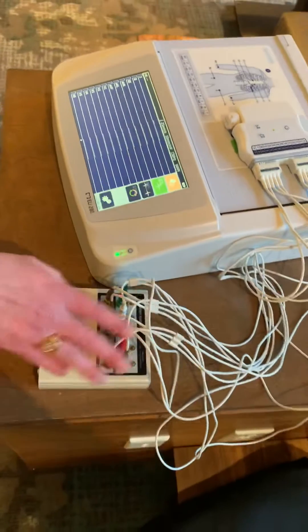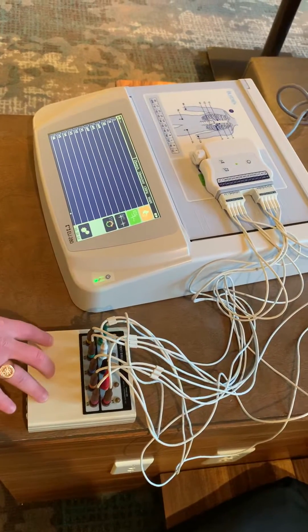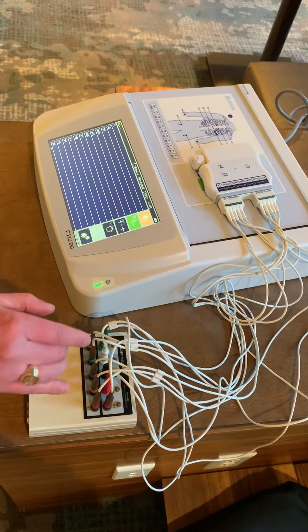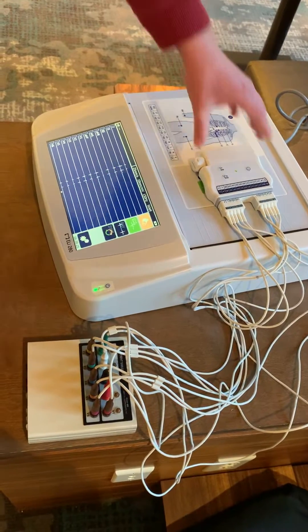I have my patient cables plugged into my patient simulator. This is essentially the patient chest — lead cables will be attached to the electrodes, which will be properly affixed to the patient. Go ahead and turn that patient simulator on.